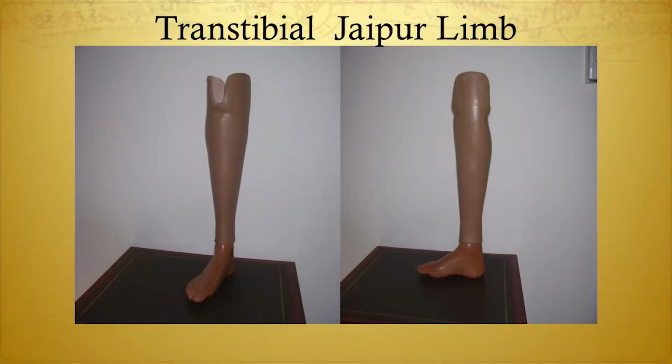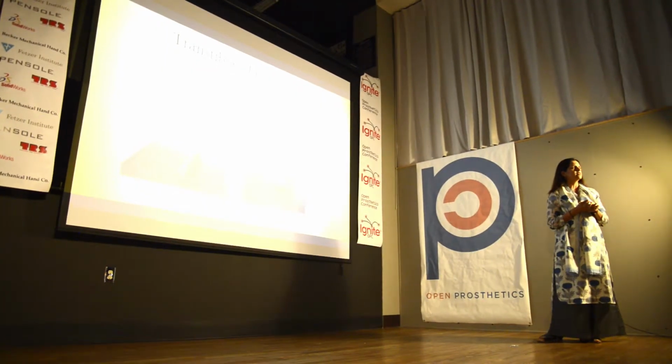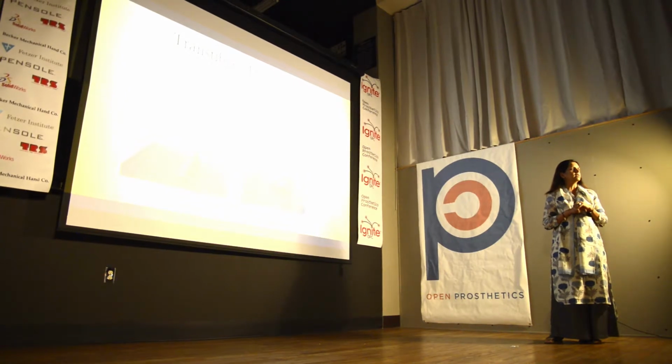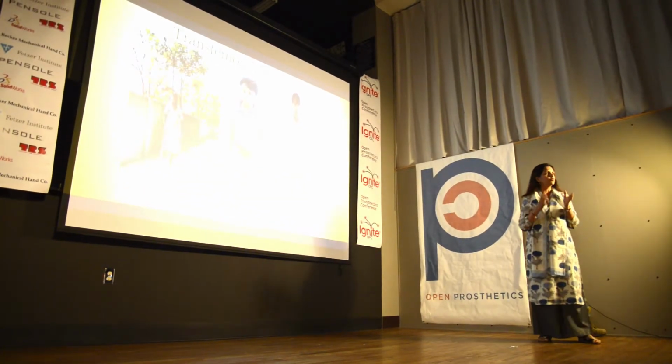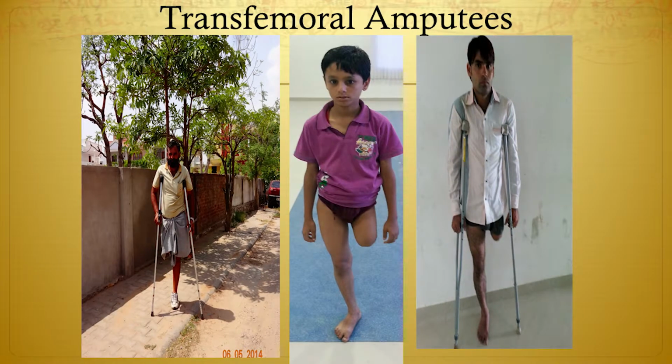This is the Transtibial Jaipur limb, and what I want to highlight here is that instead of a polypropylene sheet, which is used across the world to make sockets and shanks, we use a high density polyethylene pipe. So we are actually thermoforming a cylinder and reshaping it to form a cylindrical leg. So it's a seamless limb.